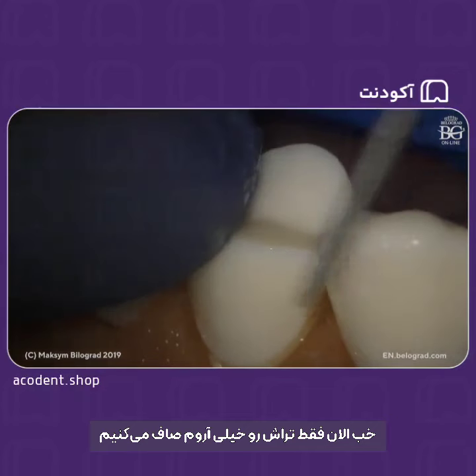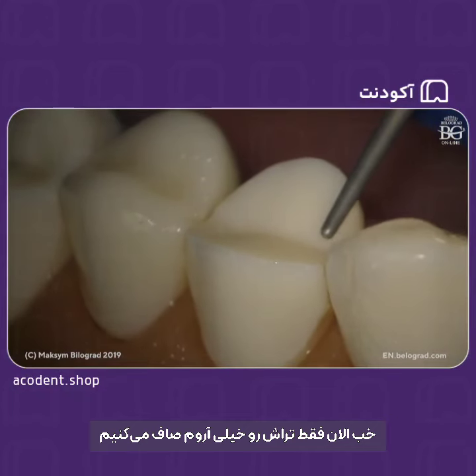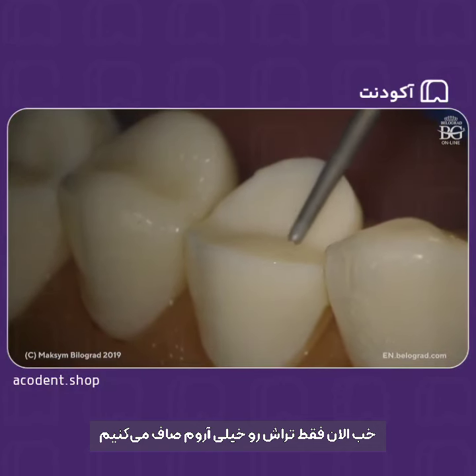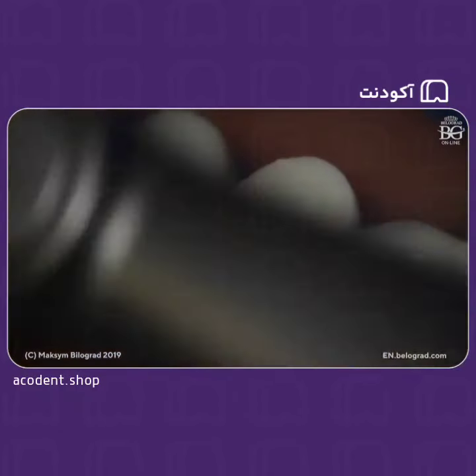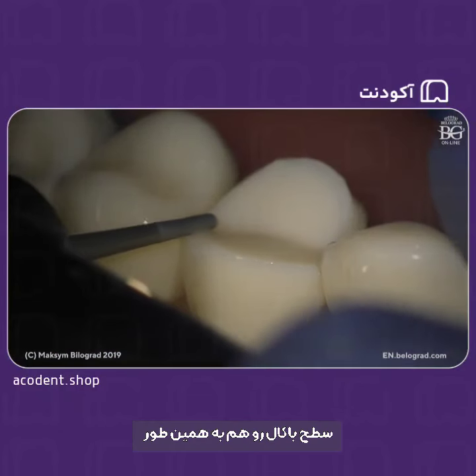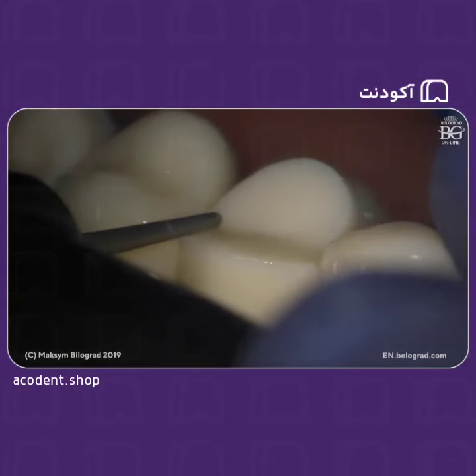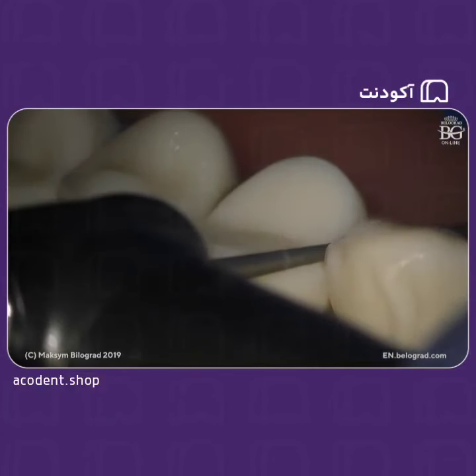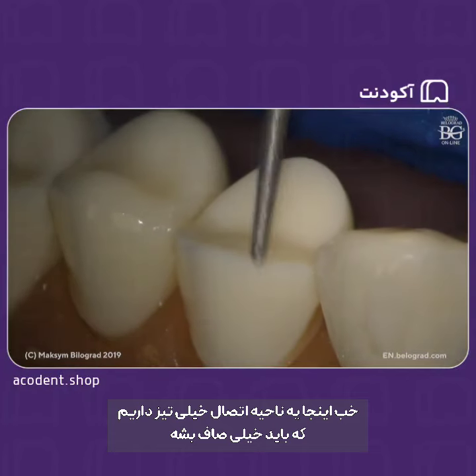Okay, so now we will just modify that preparation, make it really smooth with a red burr. Same with the buccal aspect. Okay, and you see the transition here is really super sharp.